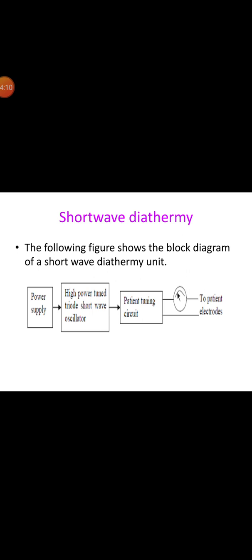Shortwave diathermy should not be used over metal implants that have circular wire components or elements that form loops or circles, because it may result in excessive heating of the metal, causing discomfort or possible injury. Some possible conditions that can be treated by shortwave diathermy are arthritis, back pain, muscle spasms, sprains and strains, tendinitis, and bone injuries, and so on.